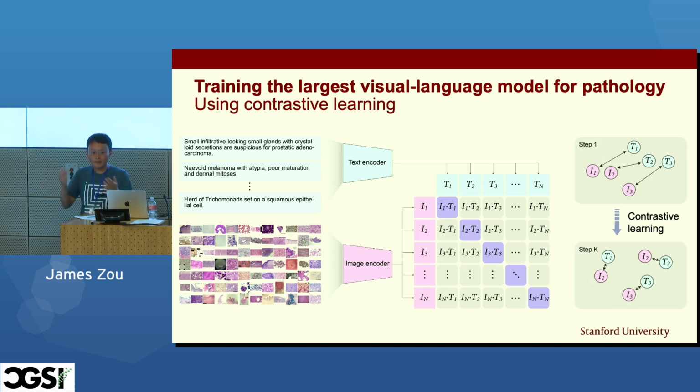There are lots of additional tricks that we can do to make this work more efficiently. So instead of, for example, just taking random pairs of off-diagonal elements, which corresponds to sampling negative examples randomly, we can have more adaptive or clever ways of sampling these negatives to force the model to learn more efficiently. This corresponds to selecting hard negatives. But the high-level idea would be the same as we have here.